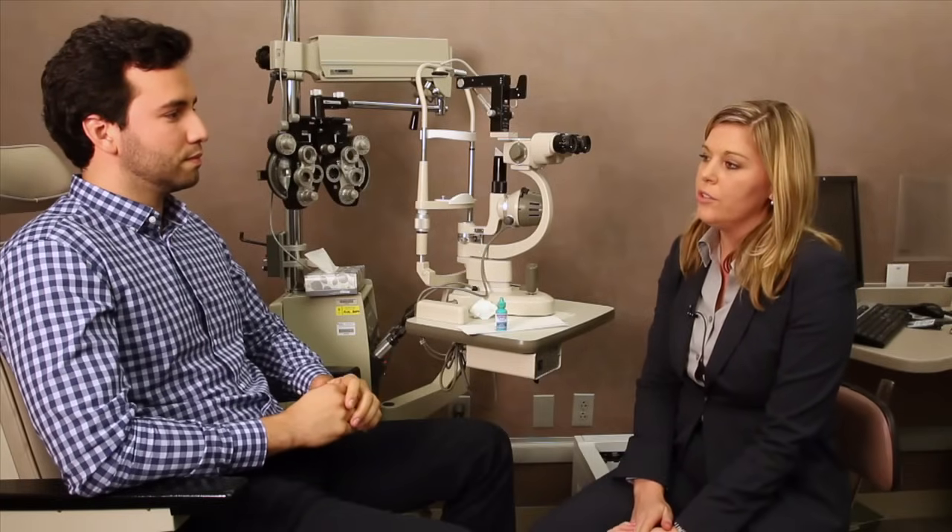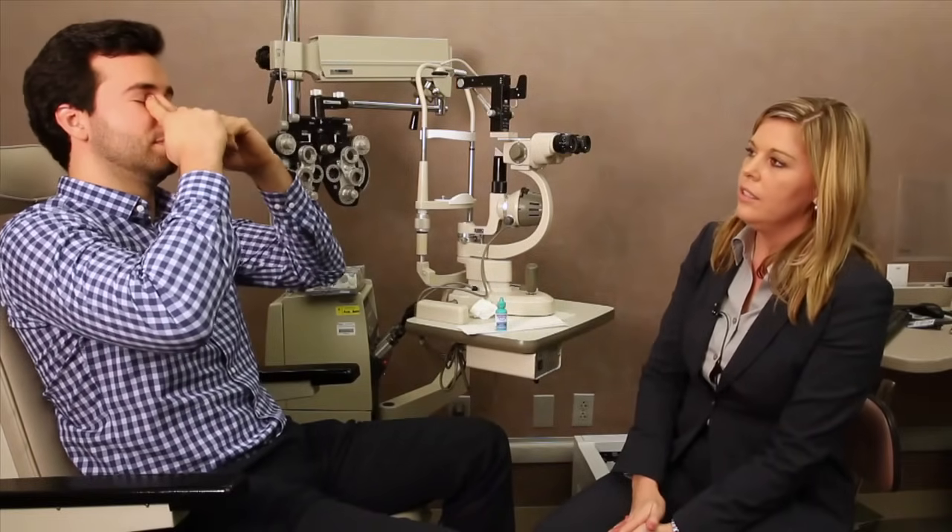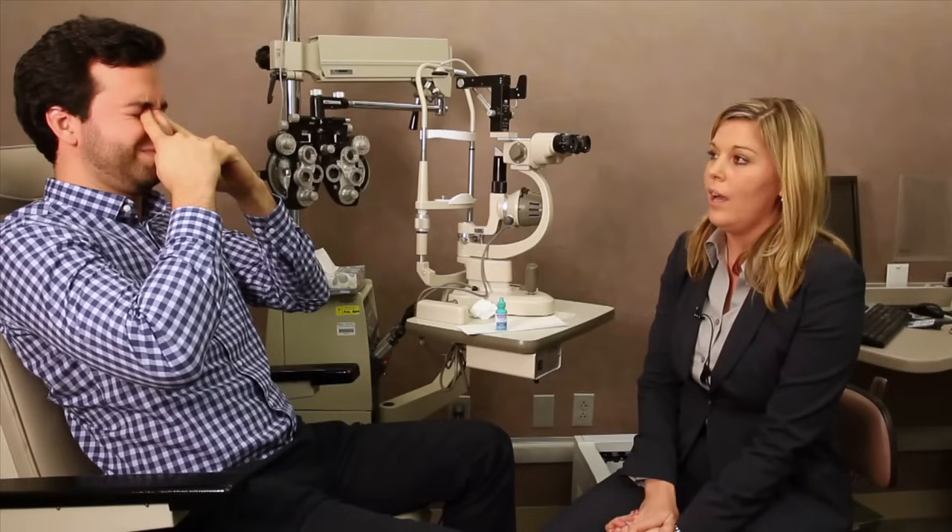Lastly, your eye doctor may recommend something called punctal occlusion. This is a technique that allows the drop to sit on the surface of the eye and prevent systemic absorption. To demonstrate punctal occlusion, you'll put the eye drop in as previously demonstrated, and you'll gently apply pressure to the nasal puncta, like so. Stay in this position for approximately 5 minutes to allow the drop to be absorbed.